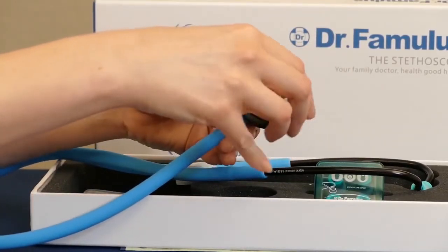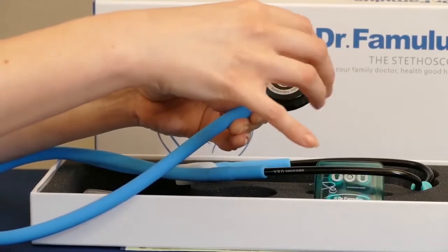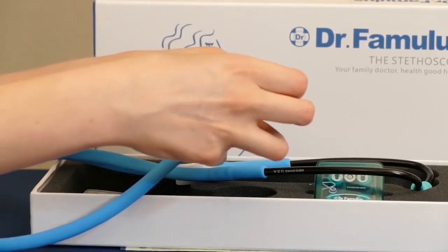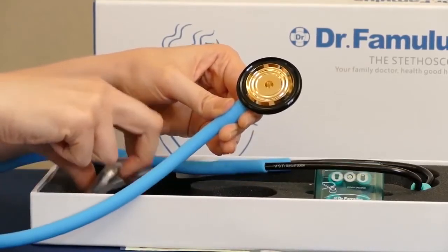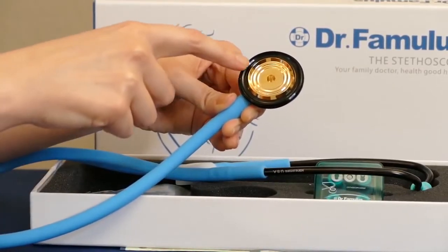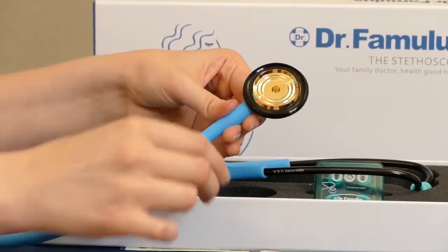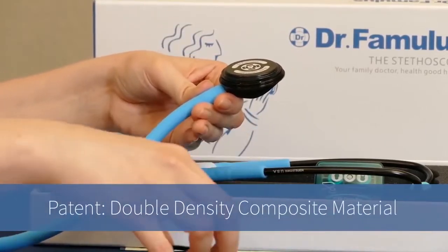Just to show you the quality here — if you unscrew the little piece, there's a vibration membrane, this little piece that actually helps to capture the sound. This can be removed and replaced with the other pieces. The collection cavity inside is actually 24-karat gold-plated copper, and they have patented this design. It's really simple to replace the pieces.